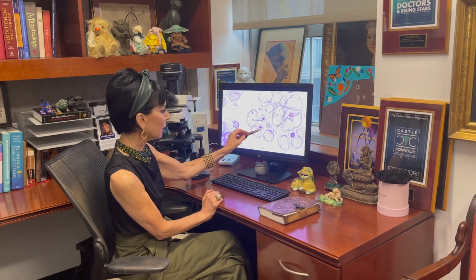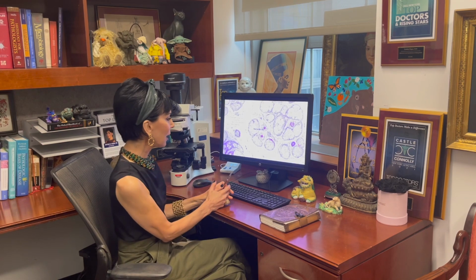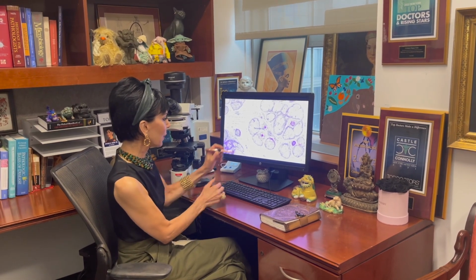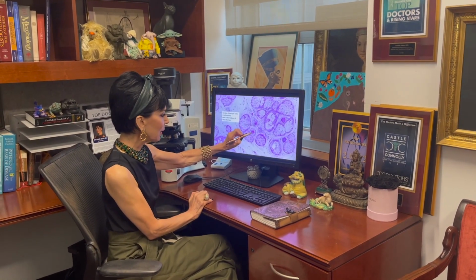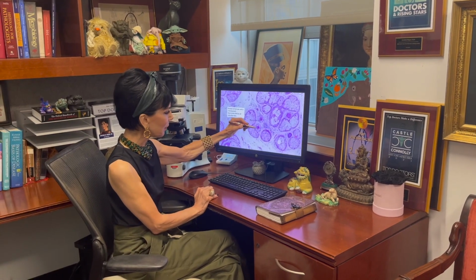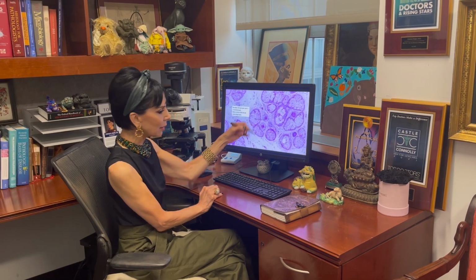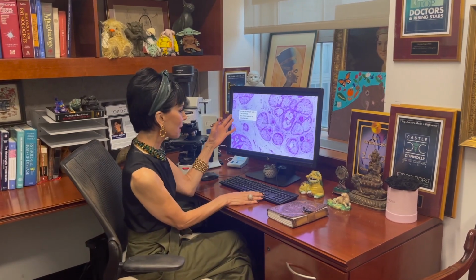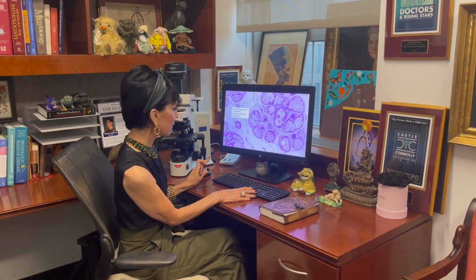So this is just a higher magnification of one of these follicular units, and you can see that most of the follicles, in fact all the follicles in this follicular unit, have a small miniaturized vellus type hair appearance. In other words, the actual hair shaft, which is right here, is about 30 microns in diameter, being of lesser diameter than the combined Huxley's and Henle's layer, which constitutes the inner root sheath. And unlike a true vellus hair, which is that peach fuzz on our facial skin, there are sebaceous glands because they represent basically a conversion of terminal hairs into these miniaturized vellus type hairs.